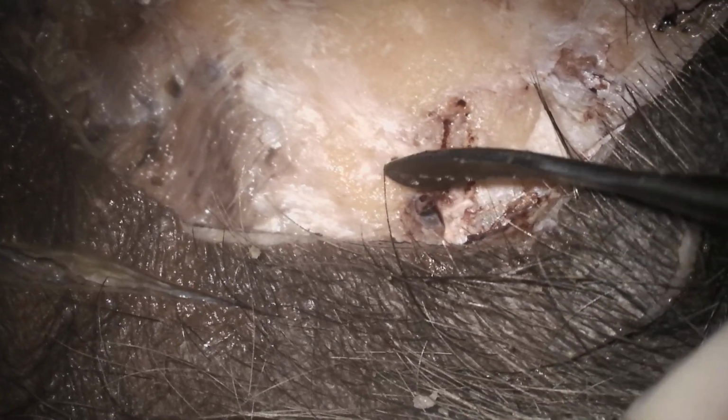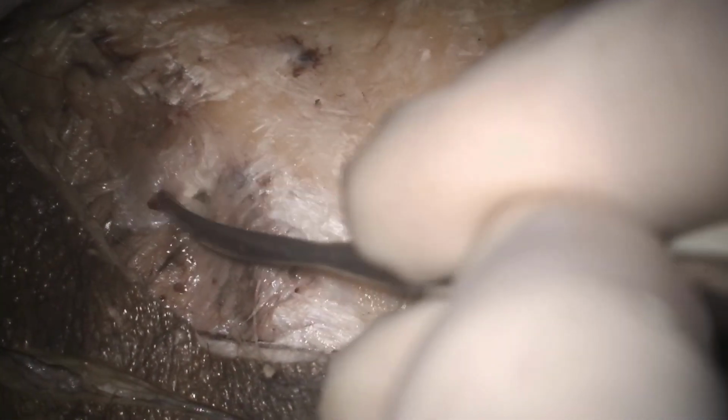So controlling this bleeding is sometimes very challenging, and you have to put some bone wax to control this emissary vein bleeding. This is a very important task. In a regular cortical mastoidectomy or temporal bone, you will not encounter this vein, but sometimes in cochlear implantation or in lateral skull base surgery, when we have to raise a very large flap, we have to encounter this vein, and for that we have to prepare with bone wax to control the bleeding of the emissary vein.